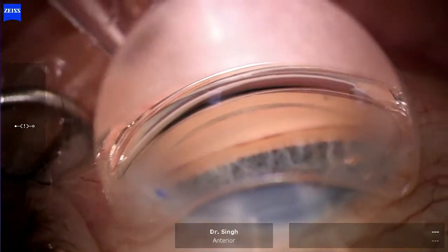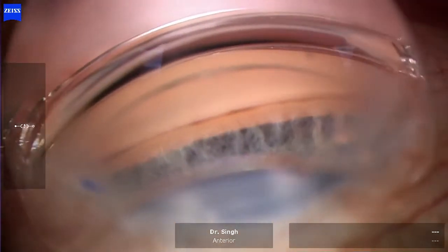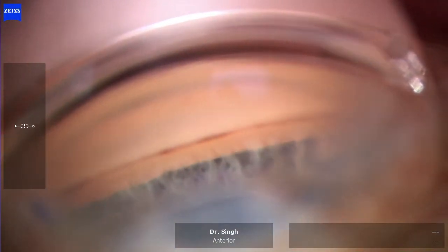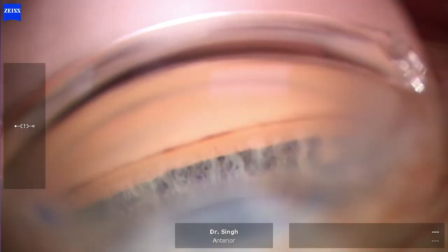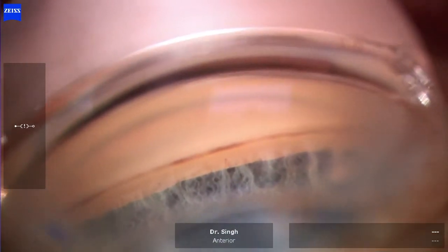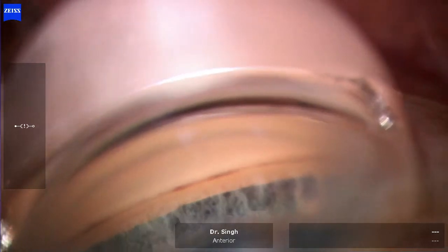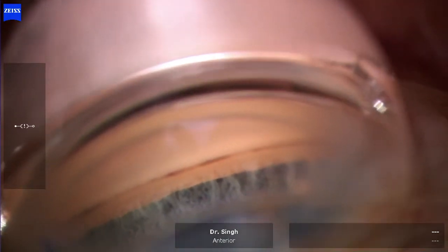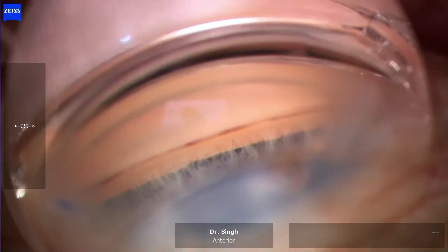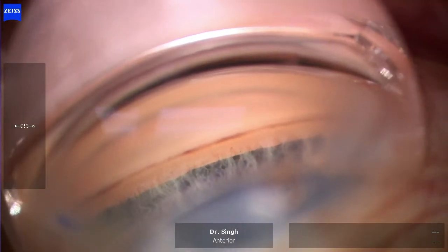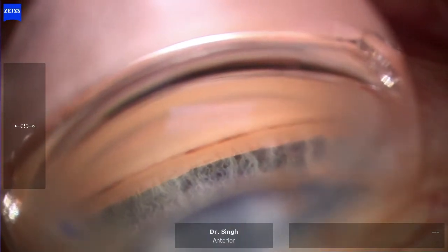Here we have a nice view of the nasal angle. I like to zoom in at pretty high magnification here — I want to see all the details of the angle structures, the trabecular meshwork, and the other structures, as well as just that en-face view. It's important for the TM to be kind of facing you here.